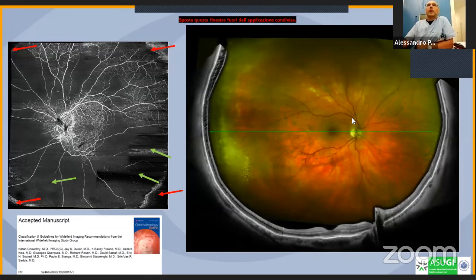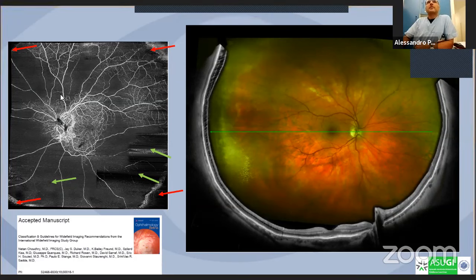And this is an OCTA scan in the periphery. We can see this type of abnormal vessels. If we do an angio-OCT in this area, we can see that this is a neovascularization that grows on the top of the retina. So the swept source angio-OCT has the ability to detect new vessels up to the limits of an Optos California ultra-wide field FA acquired in the primary position.